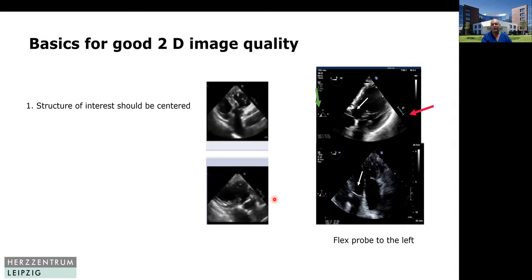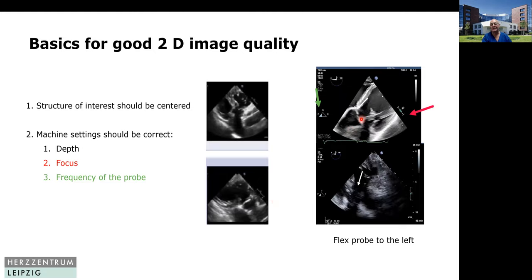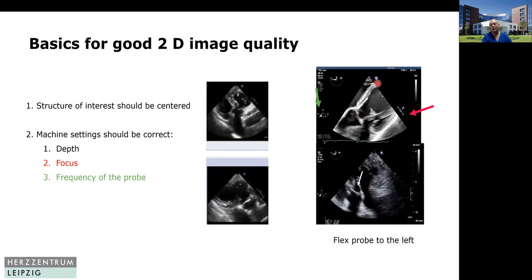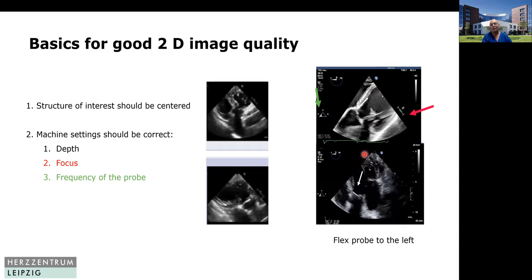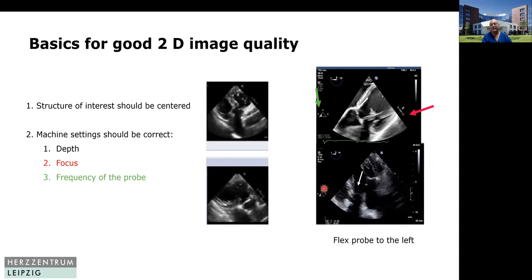In the transgastric views, the same principle applies — machine settings should be correct. If the aortic valve is not really centered, you can flex the probe to the left, where the probe is more at the apex of the left ventricle, and you see what we call more or less centered. And then the focus, again, should be in the right plane.